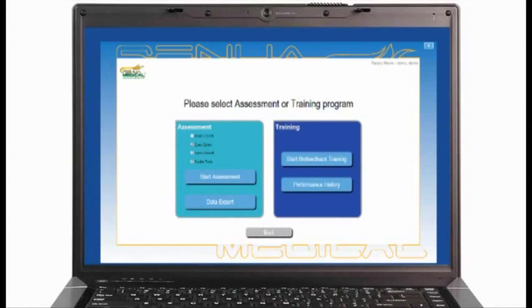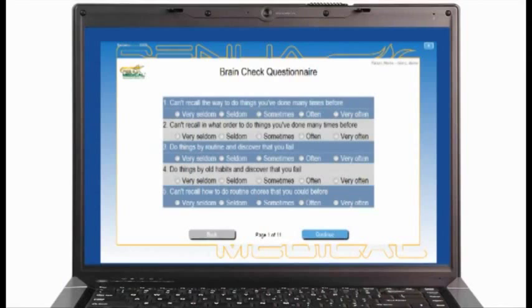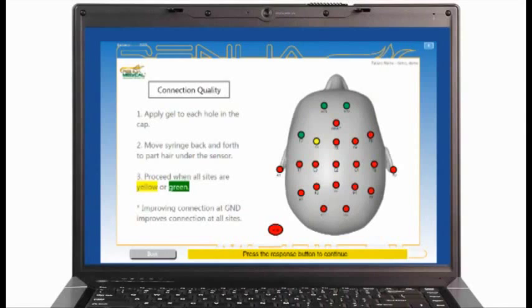You see there are four tests on the screen under the assessment side: Brain check, eyes open, eyes closed, and evoke task for the evoke potentials. Press the start assessment button. The instructions on the screen are for the patient to follow. Then you'll see the impedance or the connectivity of how well you have a connection between the scalp and the sensor.